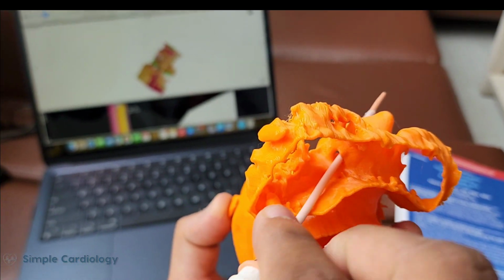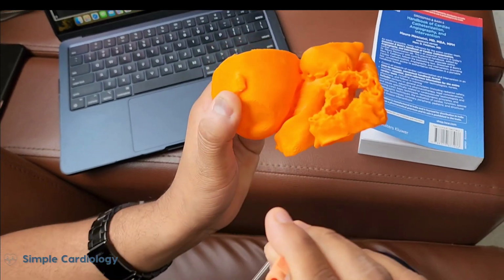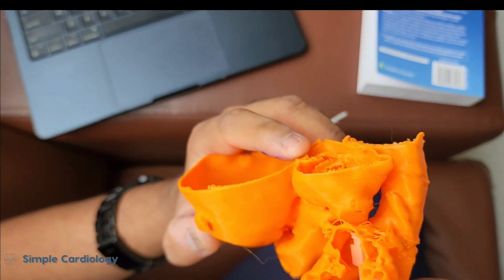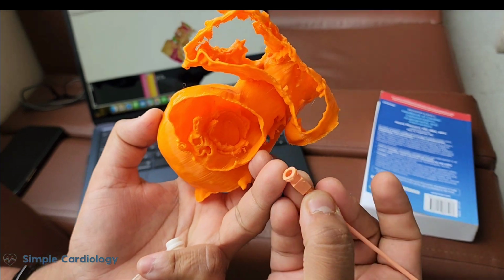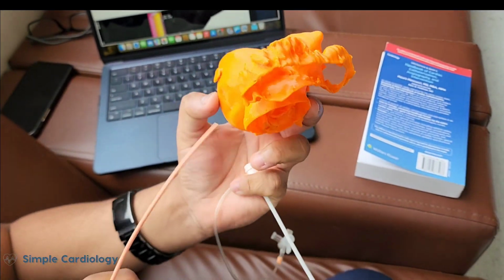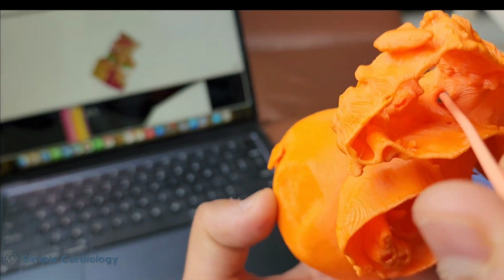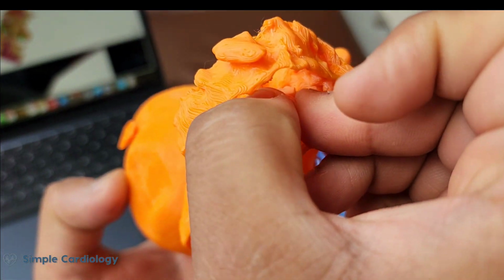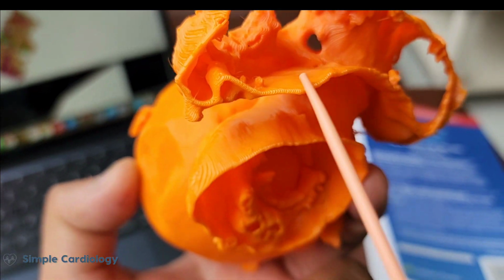And if I go like this, this is a 7 French catheter and I'll go from this and try to close it. This is completely closing it. So this would be like around 6-7 mm. So a 10 mm device would be very easily able to close this. So we know by putting a dilator here to size this defect like a balloon sizing, and then using the device based on the size of this defect.